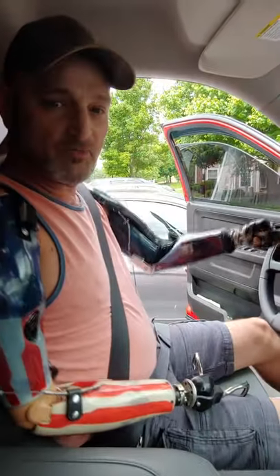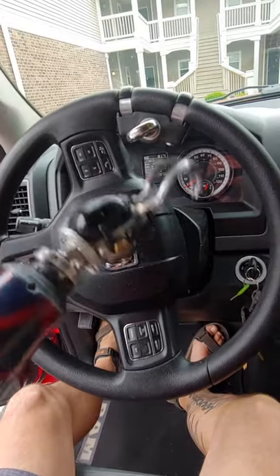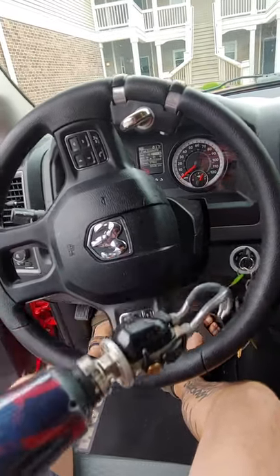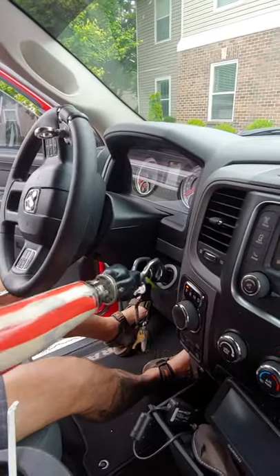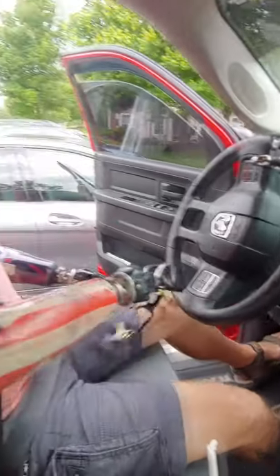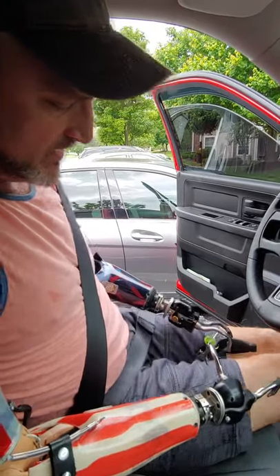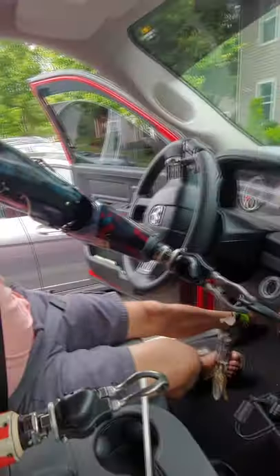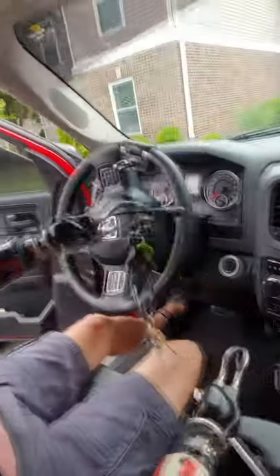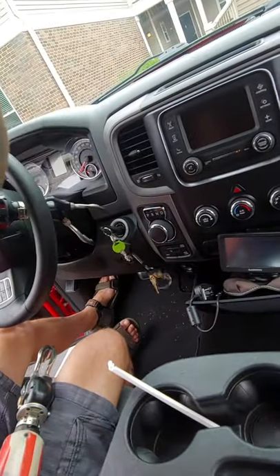Another thing I like to point out is when I park this truck, I always park it with the steering wheel turned to the right. That way it's got that big hole right here. The reason being — sometimes my right arm may not work and I may not be able to open it or get my hook off it. Sometimes I'll switch hands and have to do it with my left hand. And if you look, I can't hardly get around that steering wheel to put the key in, but if I leave it turned like this I can stick right through the hole, put it right in, and fire it up.